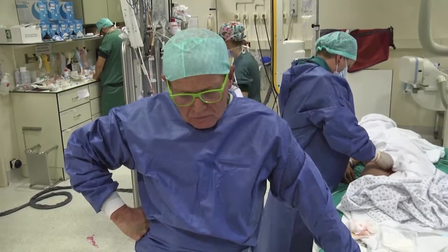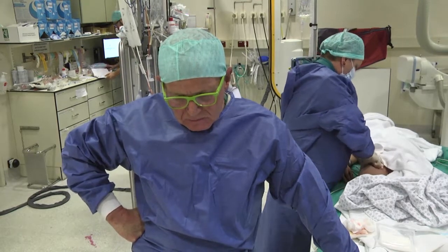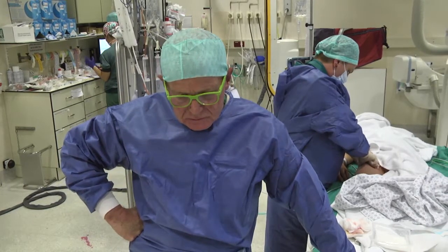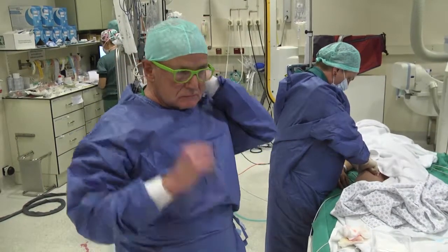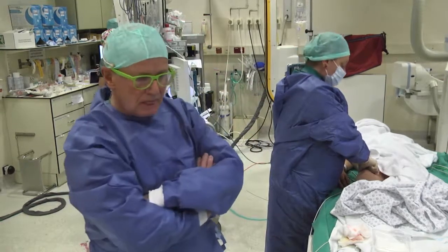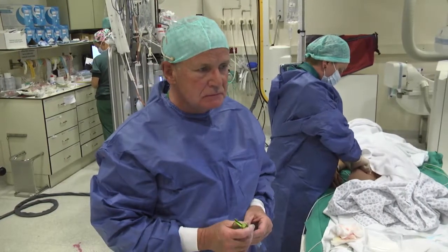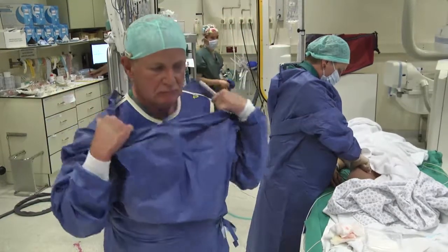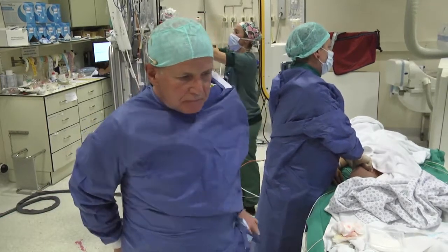And the second thing is what Ziad asked you: what sheath do you have in? Because one of the things that we've started to do is use the Gore DrySeal sheath. For instance, the standard Ensemble, not what you just did, goes through a 22 DrySeal sheath, so we never have to change, and you have no resistance when you go through the skin. This would probably be a 24, and then we do this also for the Harmony. So it's just to eliminate any pressure going through, because the system's bigger now. But mainly, do you check before you go in to see if it's perfectly on the balloon, so you don't have to take it back out again?